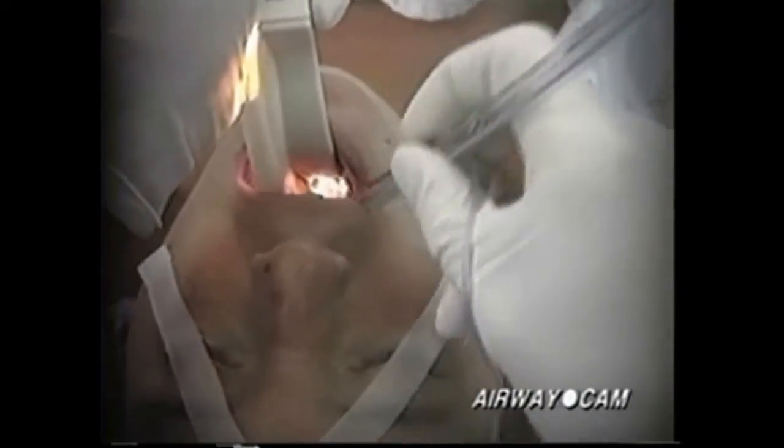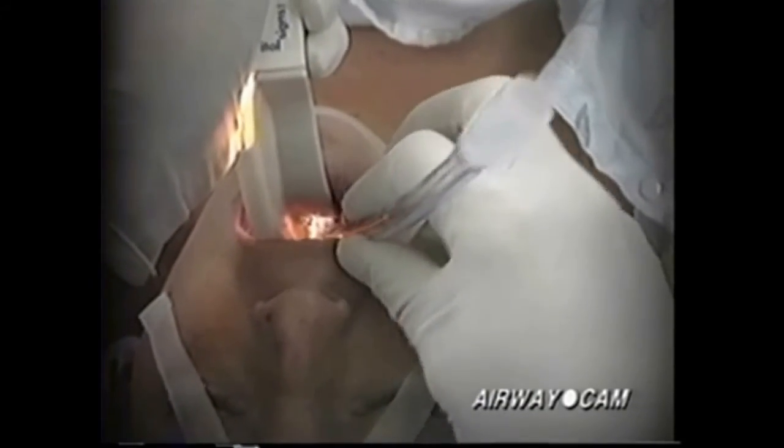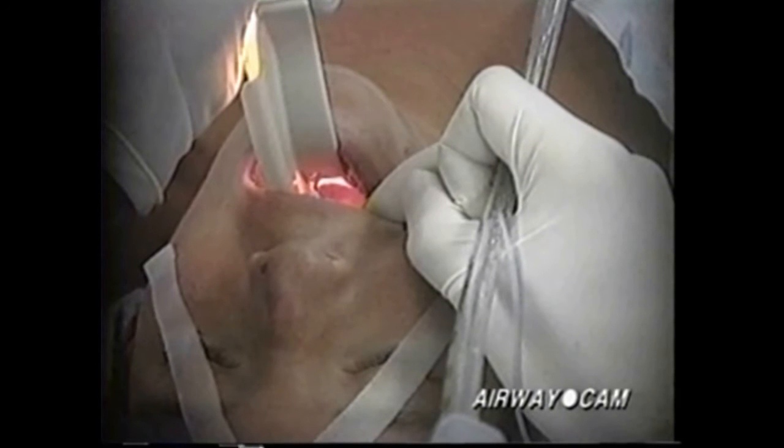The tube is then passed down the right side of the mouth. In this still shot, note how the laryngoscopist holds the endotracheal tube between the thumb and middle finger of his right hand. This allows the laryngoscopist to remain visually focused on the target without looking away in order to grab the endotracheal tube. Notice that the tube does not have a stylet. As already mentioned, styleted tubes are easier to manipulate and recommended for all emergency intubations.